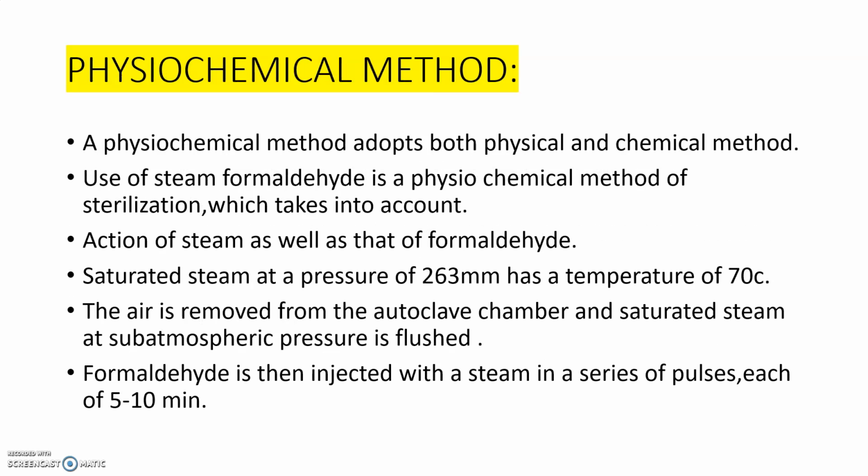Finally, the last one is the physiochemical method. We have discussed physical methods, chemical methods, and then finally the physiochemical method. The name itself indicates that it combines both physical and chemical methods. That means the use of steam and formaldehyde. Steam is a physical method, formaldehyde is a chemical method. So it's a physiochemical method of sterilization which takes into account both.